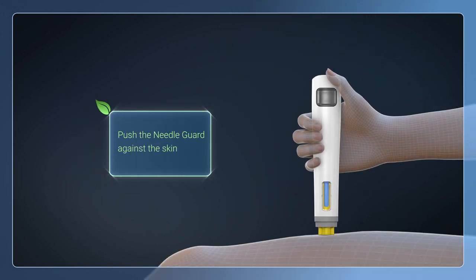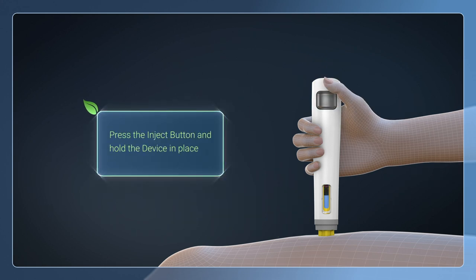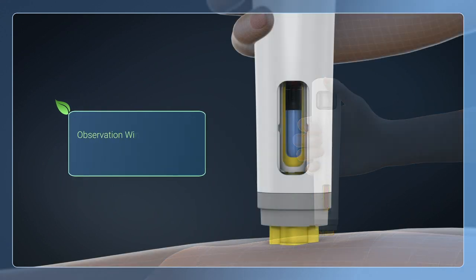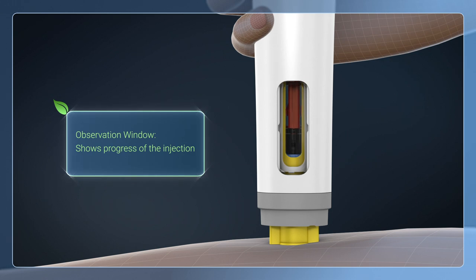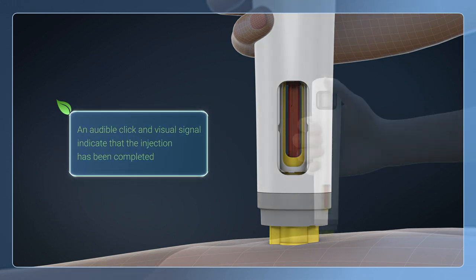Push the needle guard against the skin. Press the inject button and hold the device in place until the injection has been completed. Progress of the injection can be viewed through the observation window. An audible click and visual signal indicate to the user that the injection has been completed.